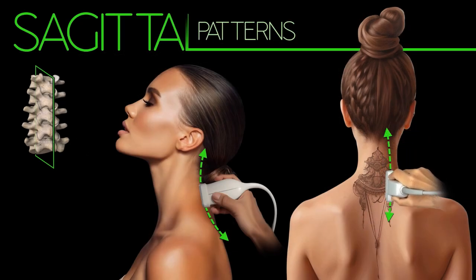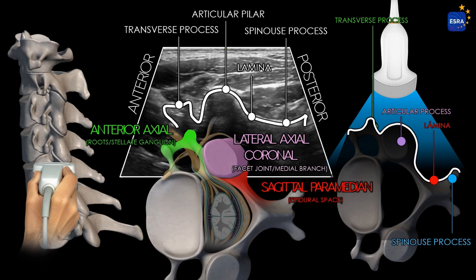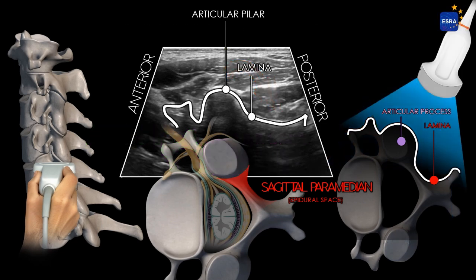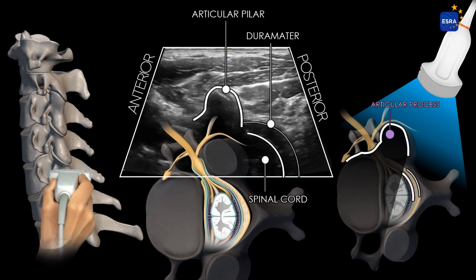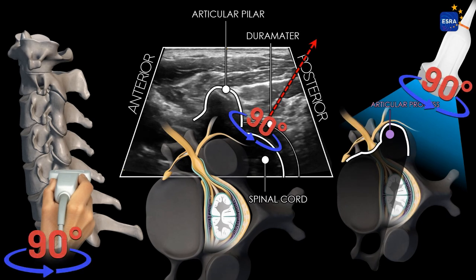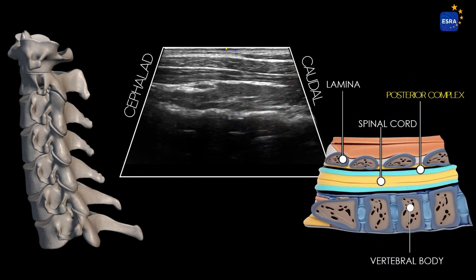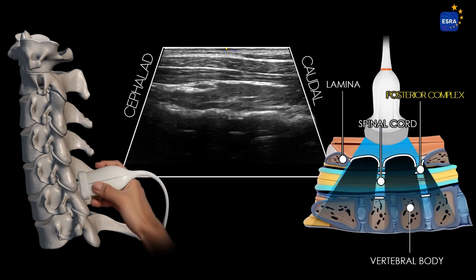The sagittal scanning axis allows for the evaluation of the neuroaxis along its longitudinal course. Starting from the lateral axial scanning axis, the transducer is moved posteriorly, allowing clear visualization of the vertebral lamina and spinous process. From this posterior axial scanning point, the transducer is moved in a caudal direction until the acoustic shadow cast by the vertebral lamina disappears. This enables visualization of the contents of the vertebral canal, including the dura mater, cerebrospinal fluid, and the spinal cord in its short axis. The transducer is then rotated to align with the interlaminar sagittal axis, where consecutive hyperechoic images can be observed in a sawtooth-like pattern, enabling visualization of the posterior complex through the acoustic window between each of these structures.